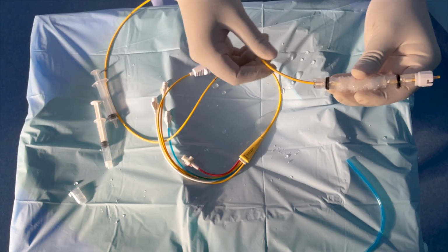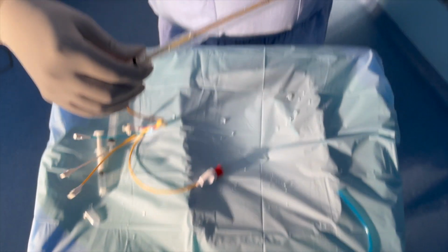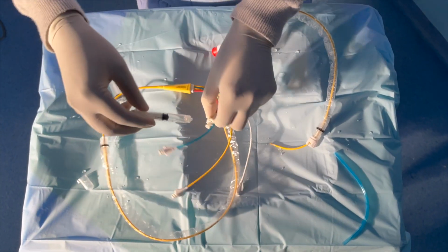Now insert the PA catheter in the transparent poly sheath for sterility purposes. Now our catheter is ready.